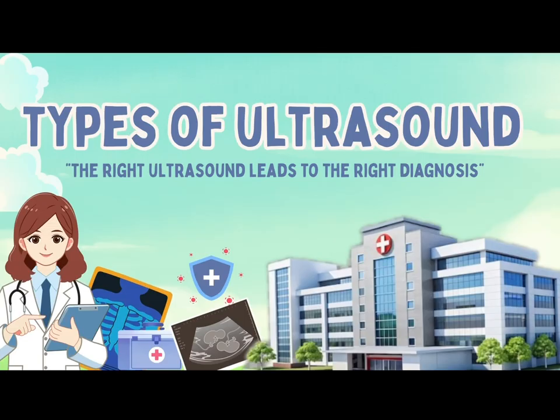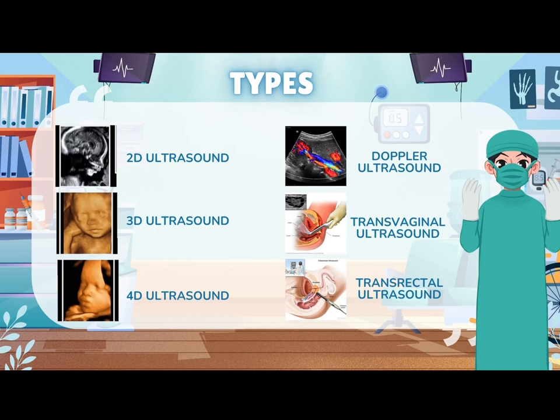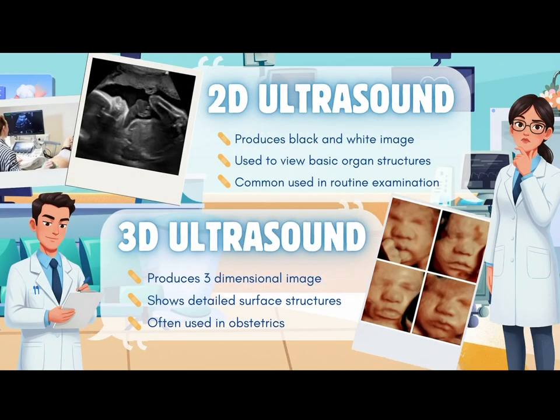Now I will explain the different types of ultrasound used in medical diagnosis. Ultrasound technology may look similar, but each type has a different function and clinical purpose. First, we have 2D ultrasound. This is the most basic and commonly used type of ultrasound.